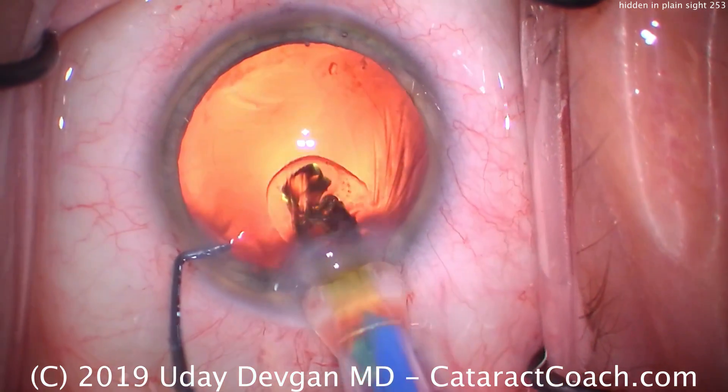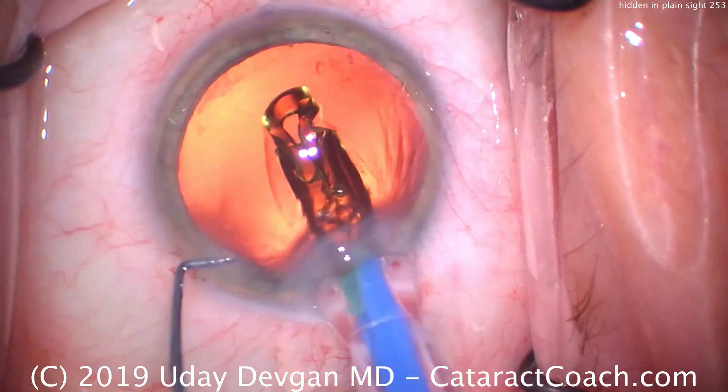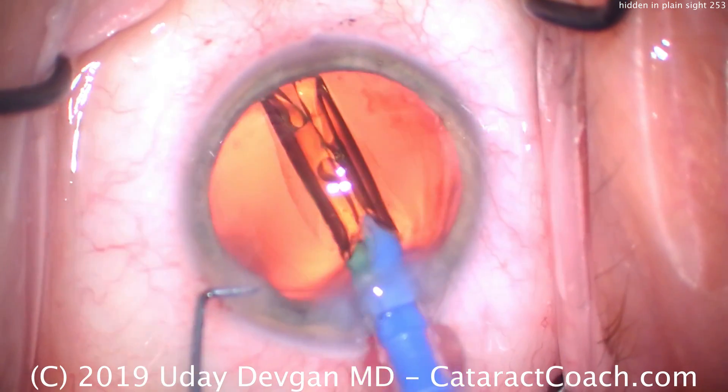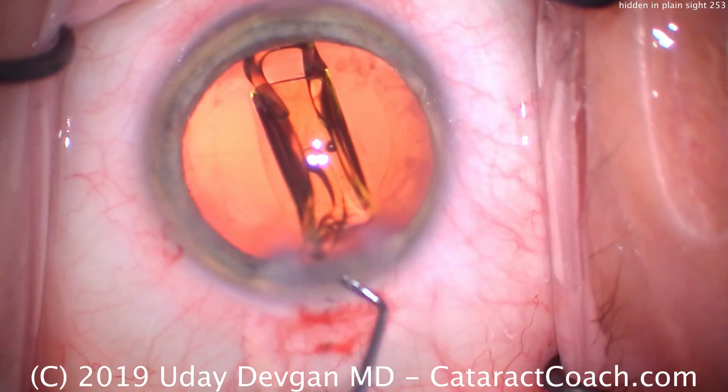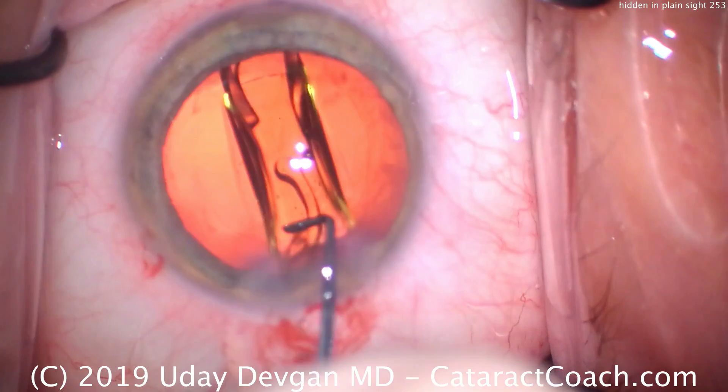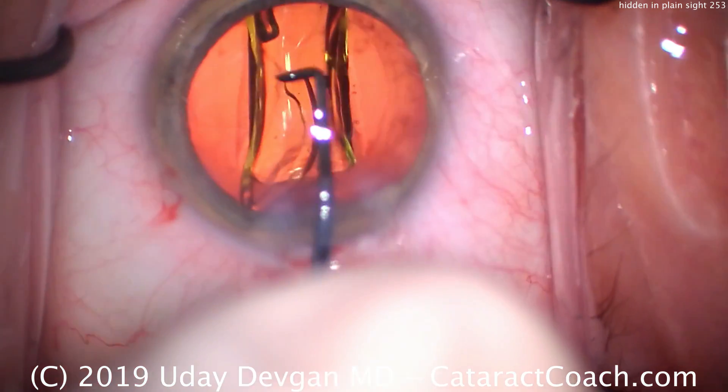Here comes the lens, start to deliver it. Goes in the bag nicely. We'll use our chopper here to help it unfold. Everything looks pretty normal — looks like a routine case here.